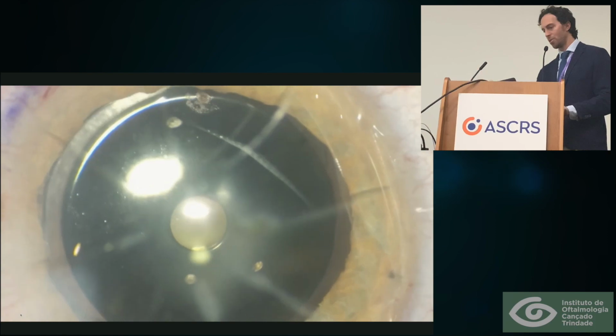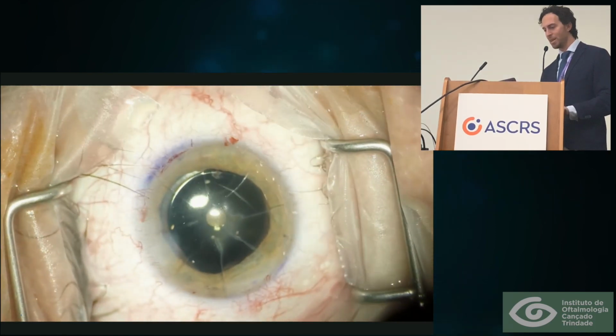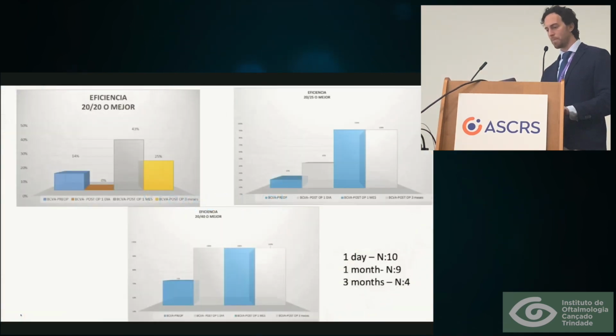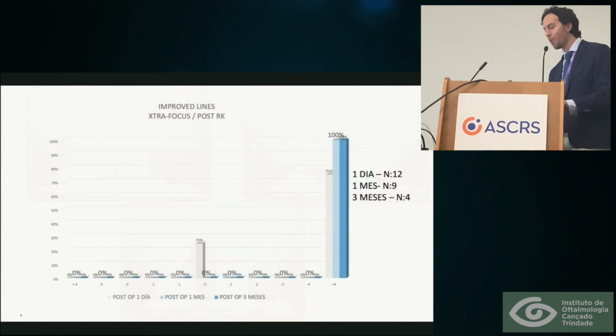And you can tell those aberrations, how they look like, and those epithelial ingrowth in the incisions. So just to go to some numbers, the most interesting thing of all for me is the efficacy and the efficiency. The most important slide is this one. On average, they win four lines. So they truly get the win, the efficacy and the efficiency. They are winning 4 lines with the procedure. And I think that's extremely important for us today.